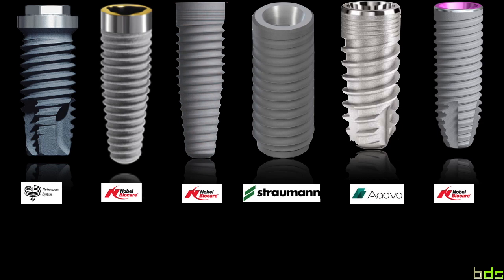We also used the Straumann bone level with an internal connection and a limited platform shifting. Later on, we also used the ADVA system that has a very nice design with a micro thread, with a limited polished collar, conical connection, aggressive apical part for tapering. And also the implant that we've been using lately is the Nobel conical implant that really sums it all up, with the new type of connection, limited polished collar, grooviness, and a good taper to catch and grab more bone stability as far as primary stability.